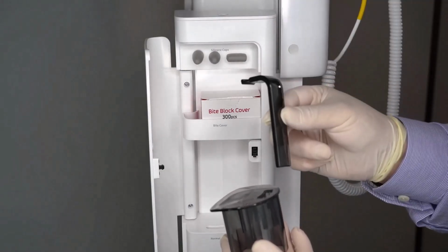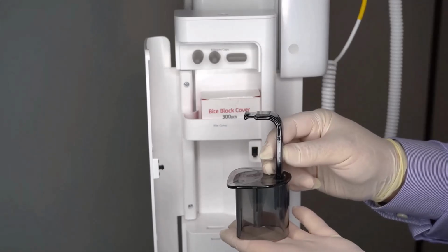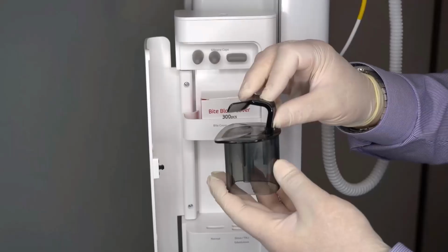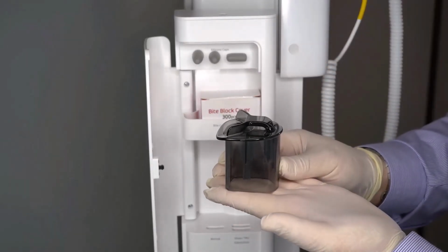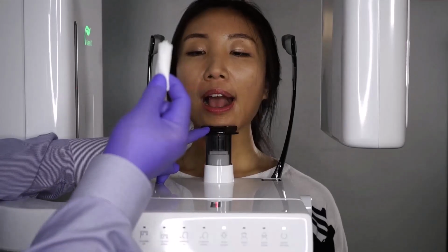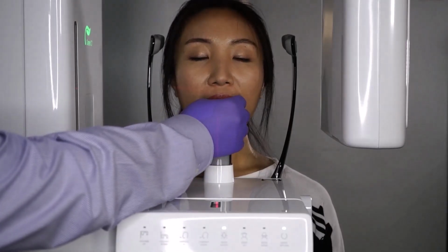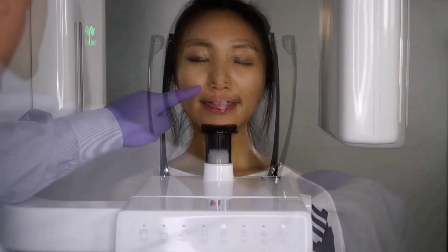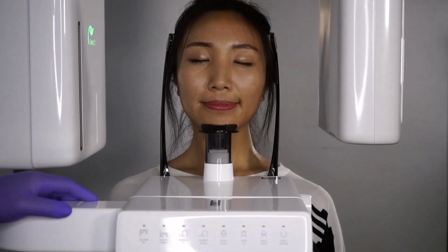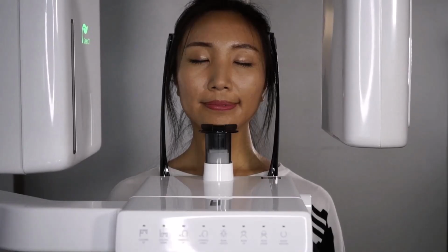Chin rest with normal bite stick. Special bite B or edentulous rest. Additionally, use a cotton roll to separate the bite. Note, this method may also be used if the clinical need requires the patient to be in centric occlusion, having the patient resting with the chin cup with the bite at rest.